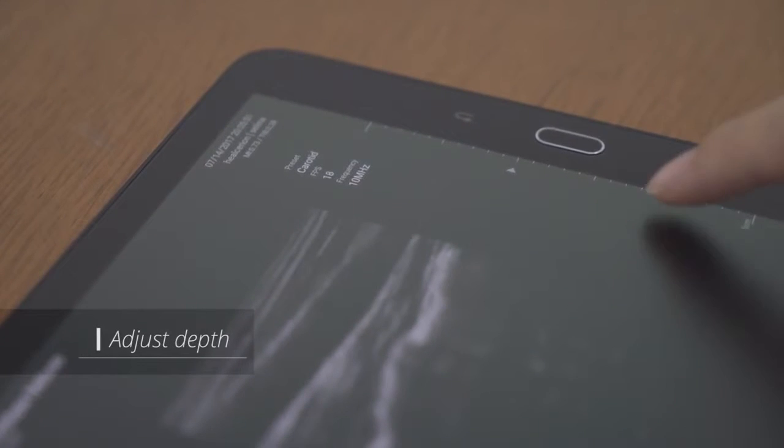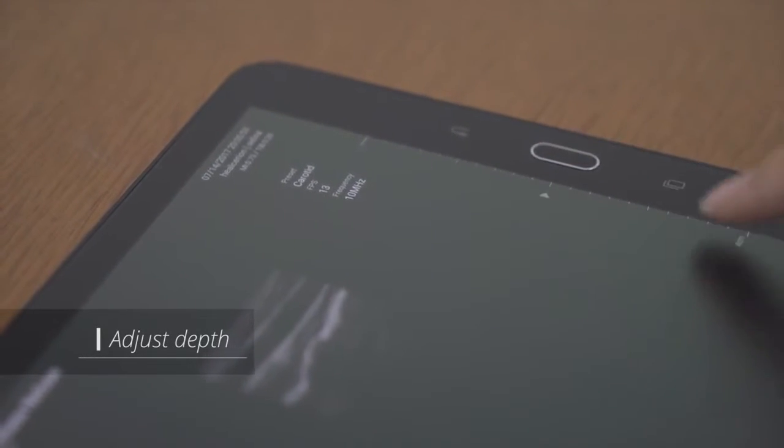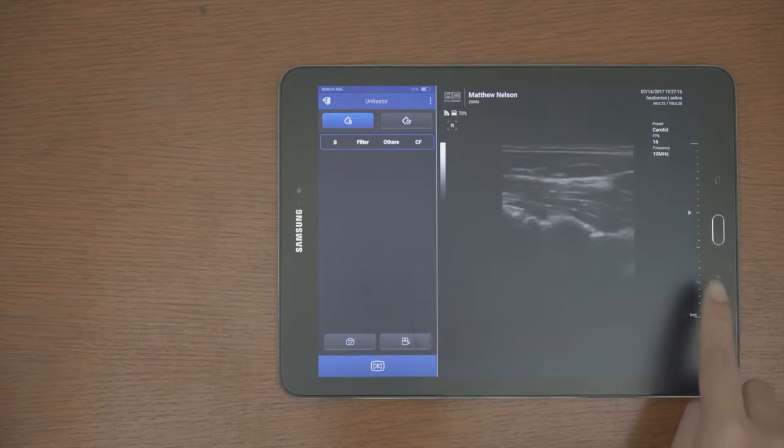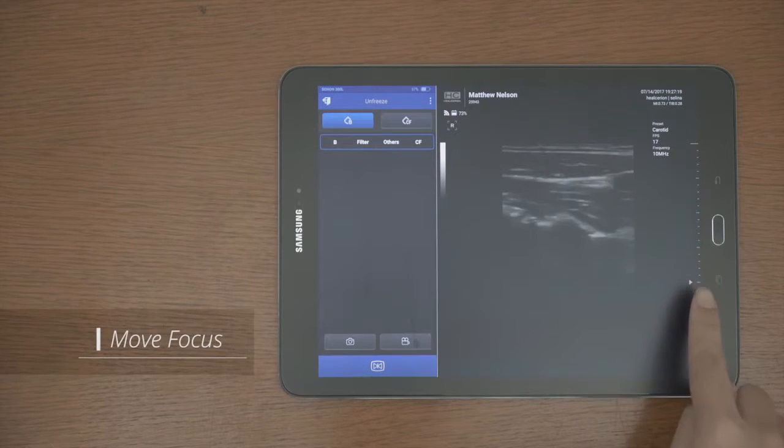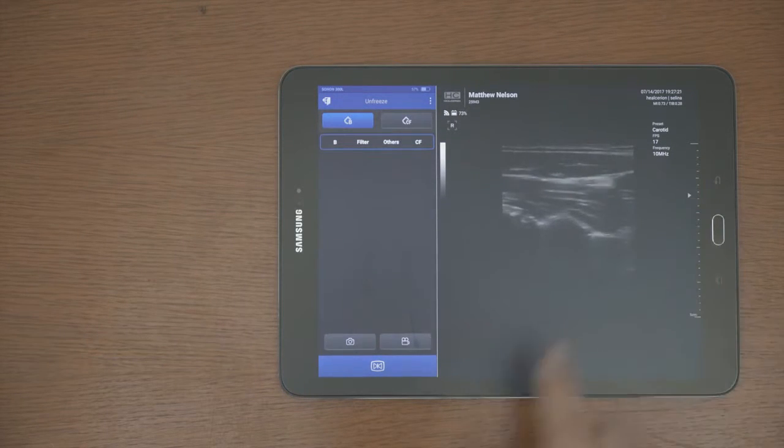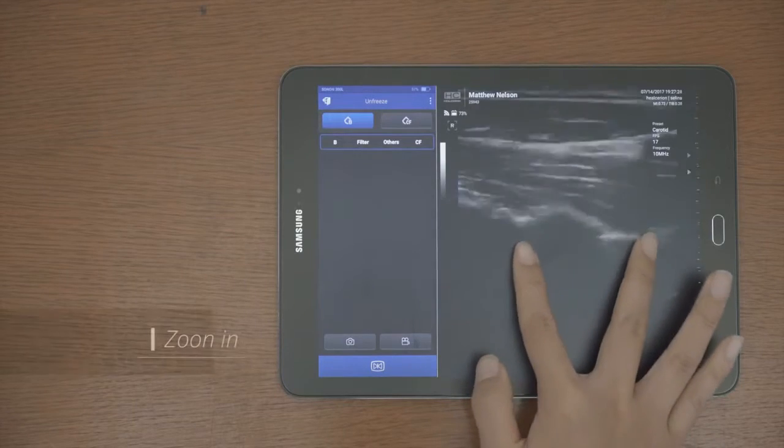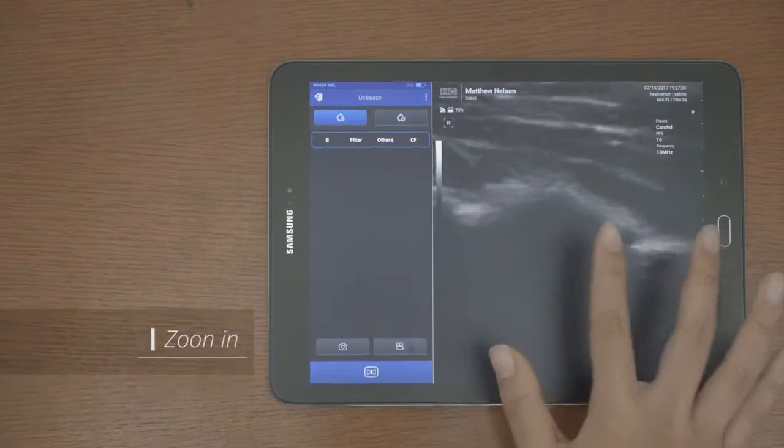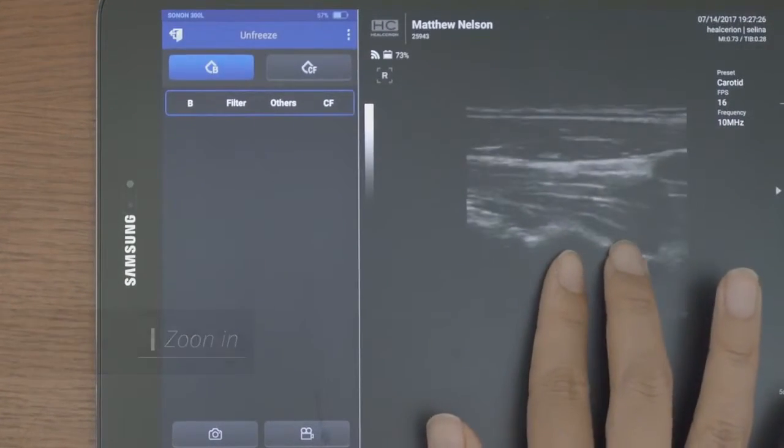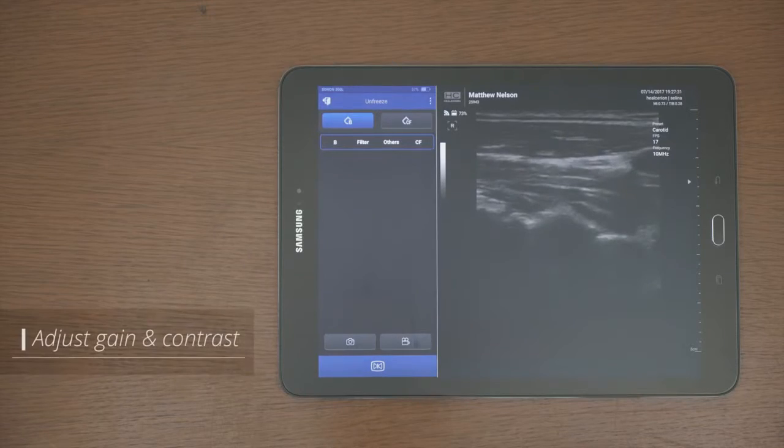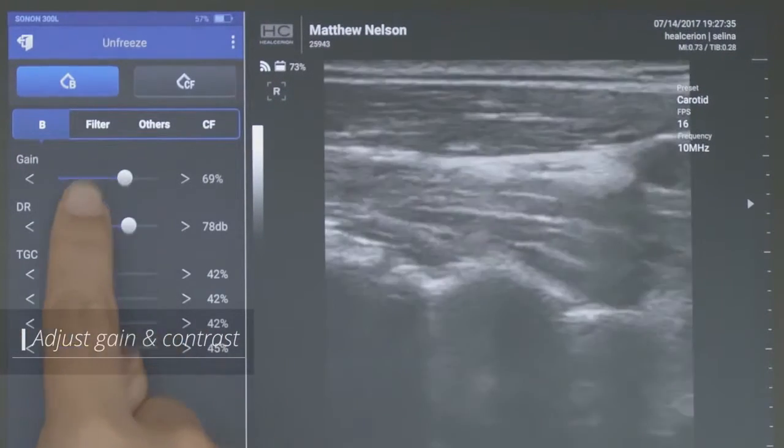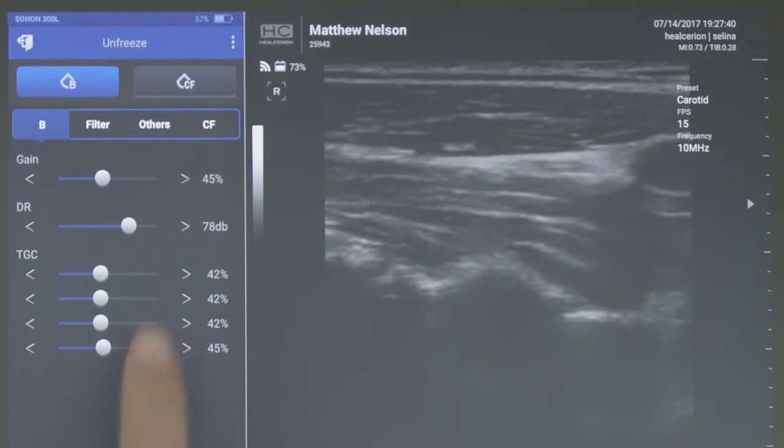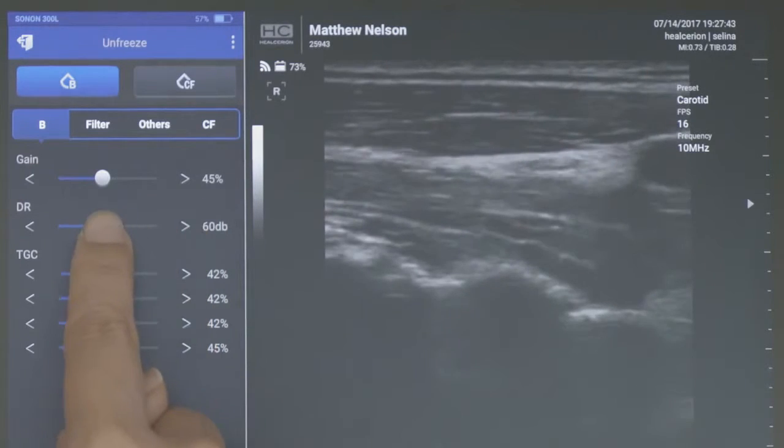You can adjust the depth by dragging the bar. And the focus moves when you tap on each part. You can also zoom in on the screen. If the image is too dark in the B mode, adjust gain and contrast by adjusting DR setting.